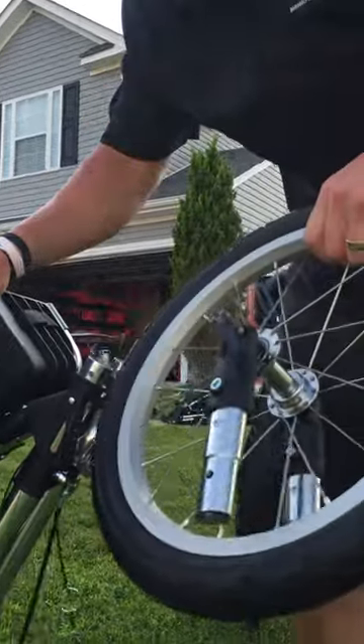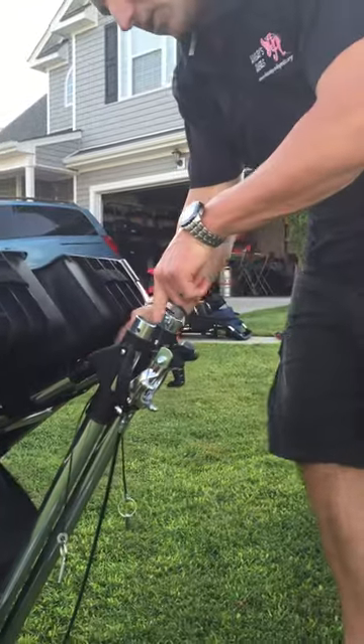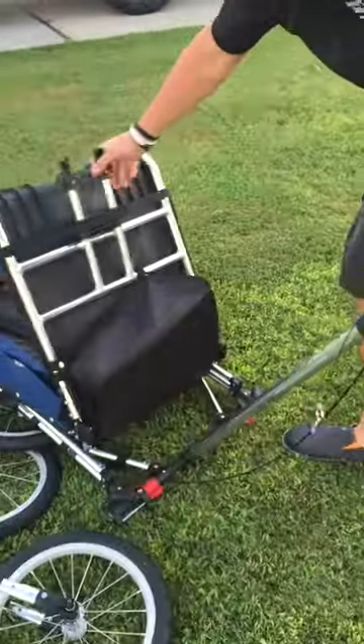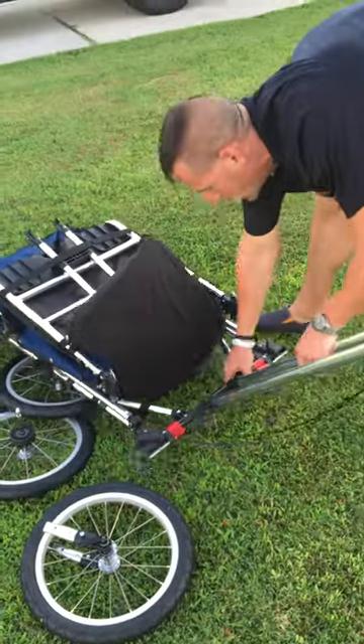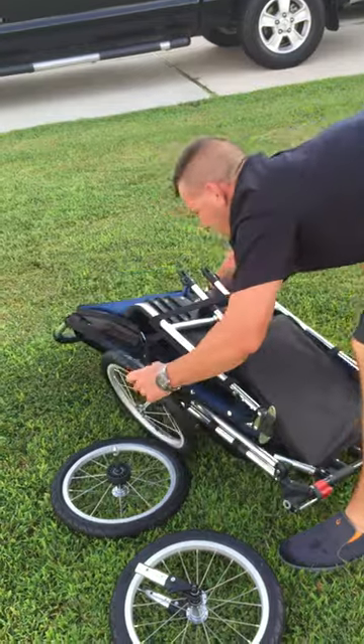We recommend keeping this whole apparatus together — don't try to remove this from the axle. At this point on the top you'll see there's a little button you press in that separates the axle from the actual frame of the chair. You push that down and you can fold this around.